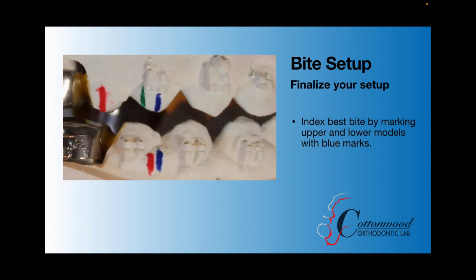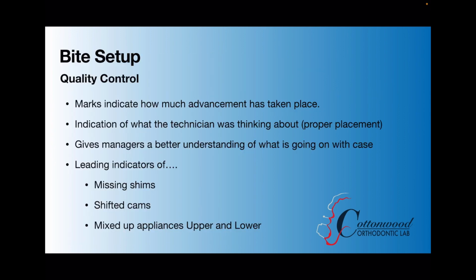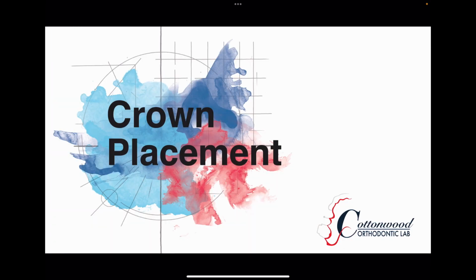We can't stress enough the importance of these 3 little marks, especially if you're a larger lab and you're having other people set this up and it's going through multiple hands as you move along. It's really important for quality control. The marks indicate how much advancement is taking place, so you, as the quality control or the manager, can know how much we've actually done and have some control over that. It's also an indication of what the technician was thinking about during bite setup as well as fabrication of the appliance. It gives a manager a better understanding of what's going on with the case. It can also be leading indicators of missing shims, shifted cams, or even a mix-up between the lower and upper appliances.